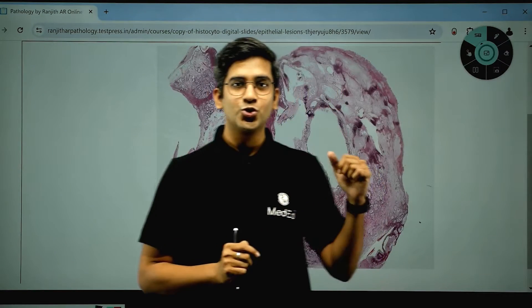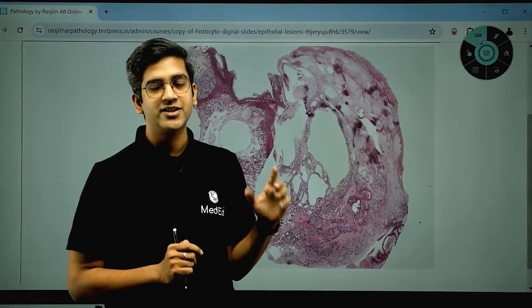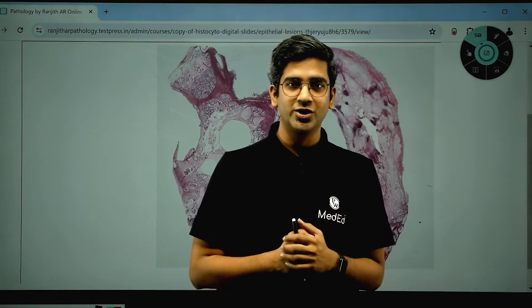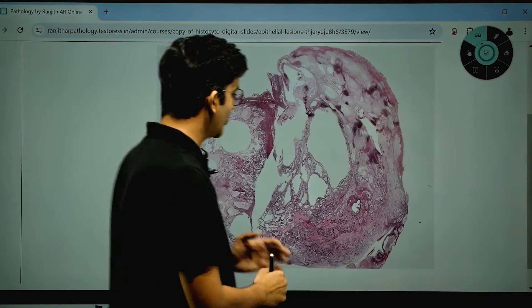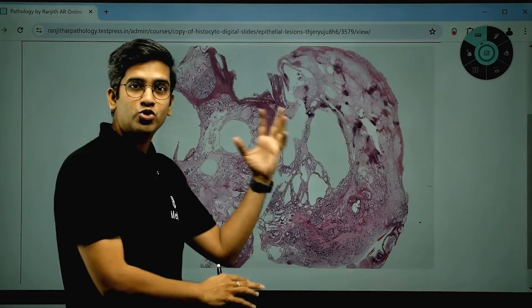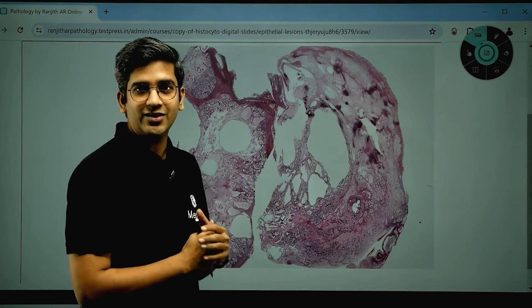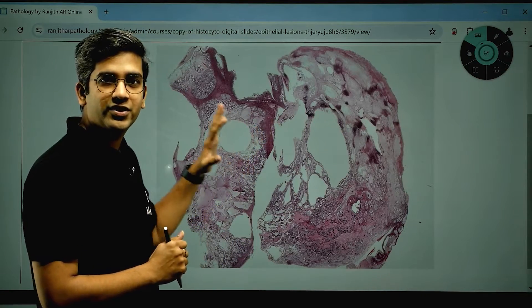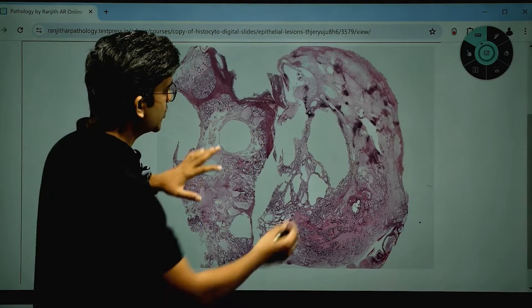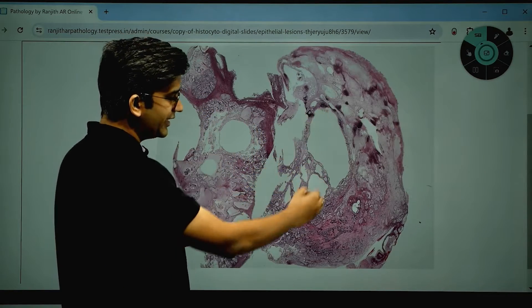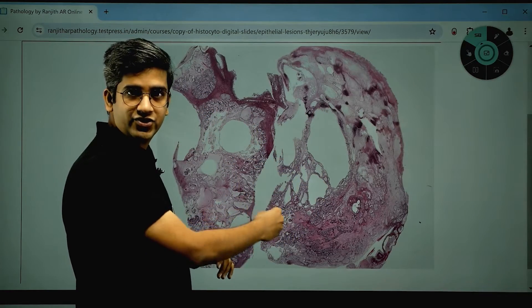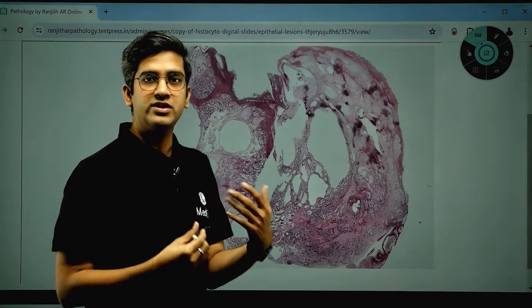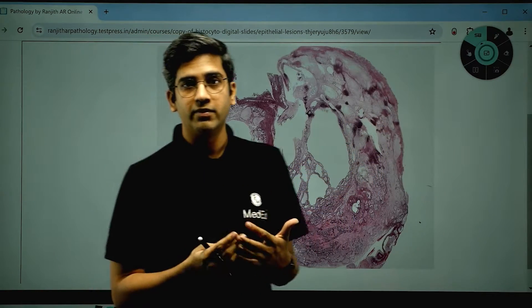Now I'm going to show you a digital slide from the archives of pathology from Pathocops. This is an ovarian mass — at the most low power scanner view, I can describe it as a mass with predominantly cystic architecture and a little bit of solid areas here and there. That's how I describe it on lower power.